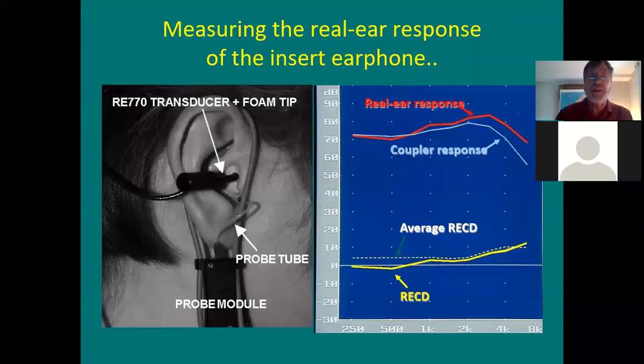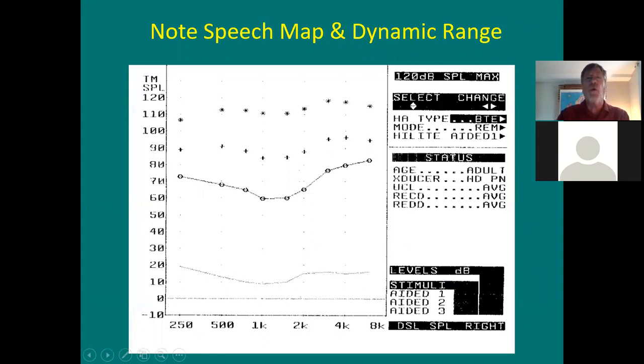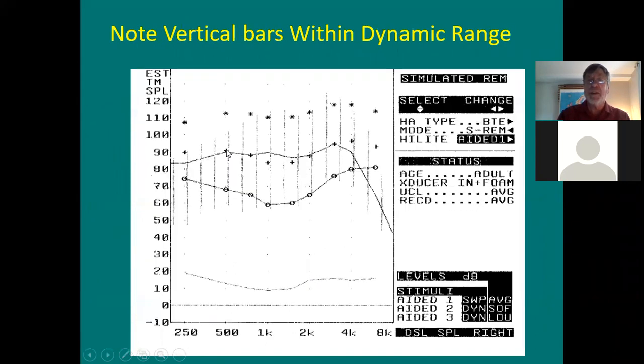Share screen. I think we've just gone through the worst thicket of today's real ear. Yikes. Okay. Here's an early, actually this is new real ear, but the first version of it. Look at normal here, MAP on the bottom. Here's someone's thresholds, a fairly flat loss, I guess. Here's the DSL-4 targets. You know they're DSL-4 targets because they're halfway inside the dynamic range. And then here was the output for average speech inputs, looking pretty good, but still old DSL-4, so it's too much. And then you'll see these weird lines, and you can kind of see where they intersect. This one here ends about here, and this bottom line kind of ends about here. You can see where they sort of double up a bit.